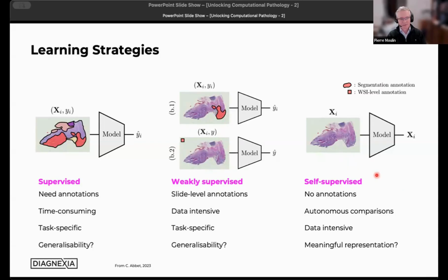Lastly, which is very fashionable at the moment, is the self-supervised approach, where data scientists and engineers are trying to overcome the scarcity of ground truth, because it takes us time and energy, by tricking the algorithm, or tricking the model, into identifying pictures that are different from each other in the training set.